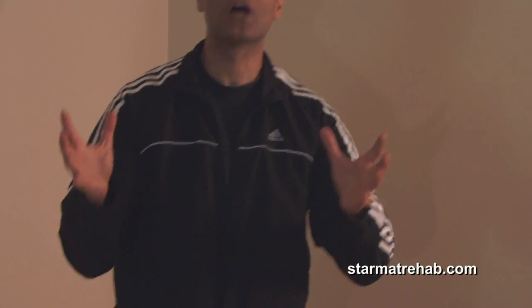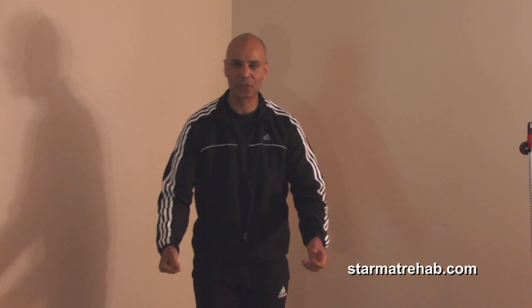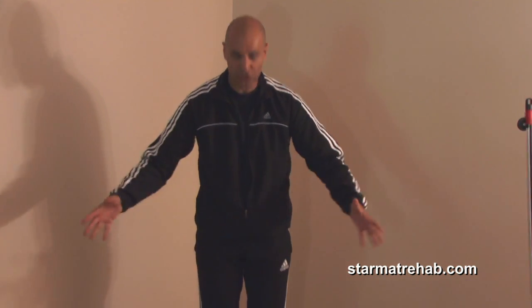These exercises can be done by people who've had bilateral hip replacement using a walker, or by a high-level athlete. Let's assume you have a patient who's had bilateral or single leg hip replacement using a walker. We're going to do the step star exercises on the star mat.